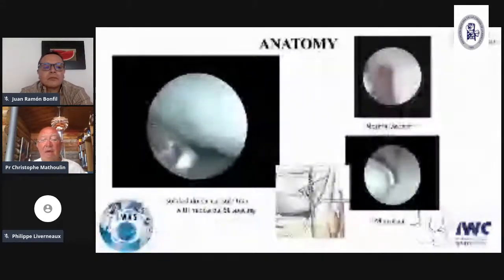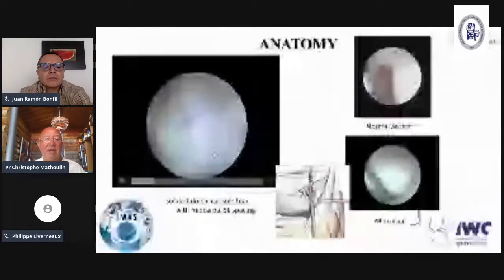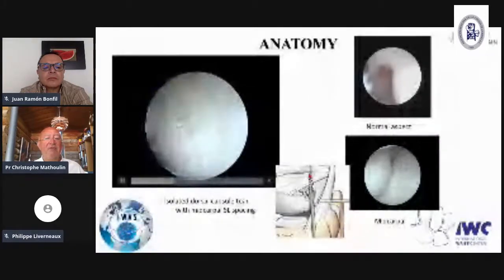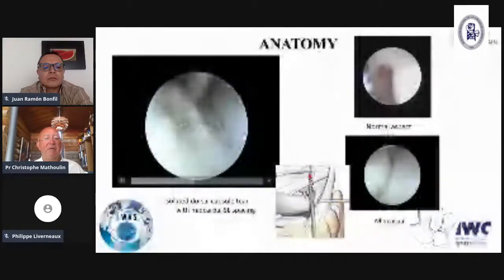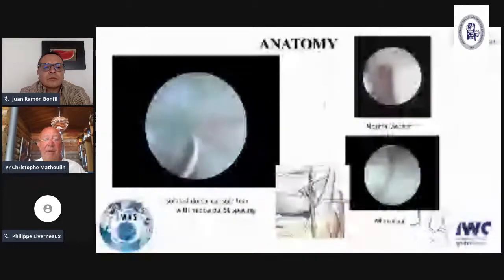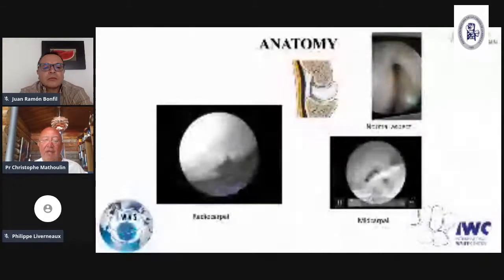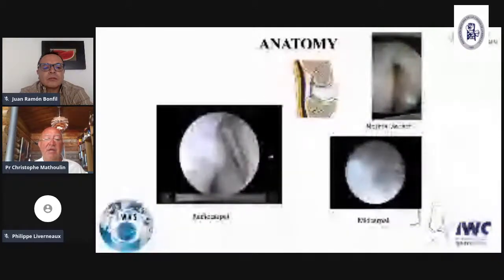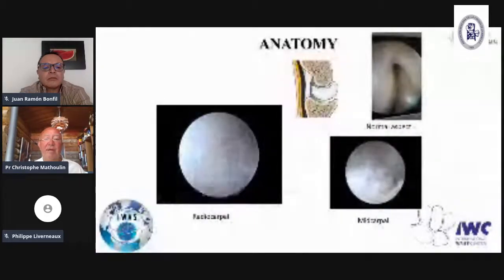And when I perform arthroscopy, sometimes I see a small instability, and the ligament is completely normal. You see here the normal aspect. And when you follow the dorsal part of the scapholunate ligament, you see here there is a rupture of something. And it's very interesting. And you see, I can go until the midcarpal joint. It is the same, a small 2B instability, very small, it's not important. The ligament is intact. It is a normal aspect. Here you see the detachment between the dorsal capsule, extrinsic ligament, and the dorsal scapholunate ligament.